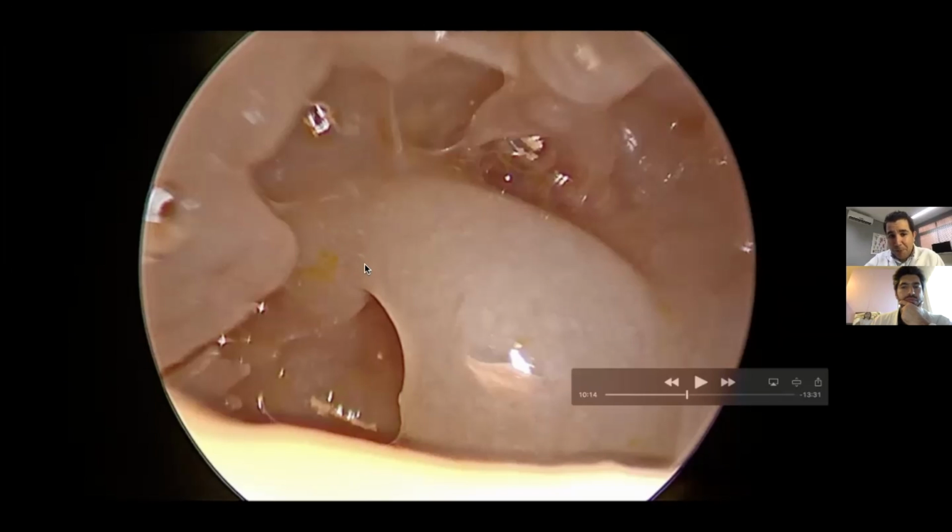The region between the posterior pillar and the styloid prominence, we call subiculum. So this is ponticulus, subiculum, and between the ponticulus and the subiculum, we have this sinus tympani. So what is the sinus tympani? It's a recess at the retrotympanic area of the middle ear located between the ponticulus superiorly, subiculum inferiorly, promontory of the cochlea anteriorly, and facial nerve posteriorly. So this is the sinus tympani.